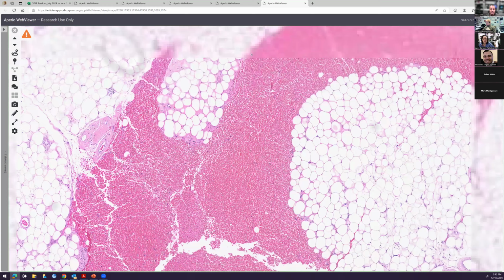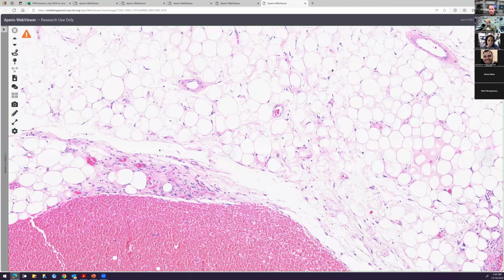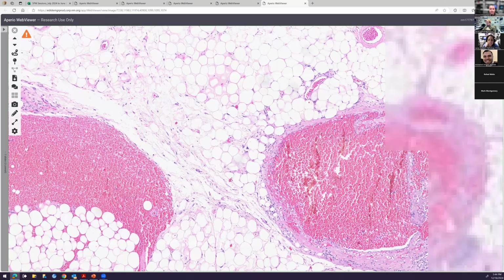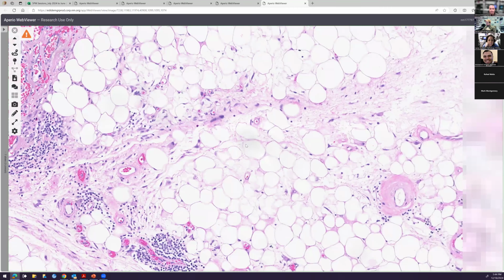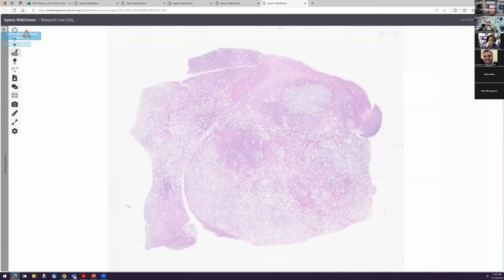That said, pretty sure this one also had some atypical cells, like right here and here, that are more defining for ALT, right? So this was also a well-diff liposarcoma. Here's another one right there. And here they are. These guys are pretty defining. Cool. All right, let me see if there's any more here. Or are we all good?